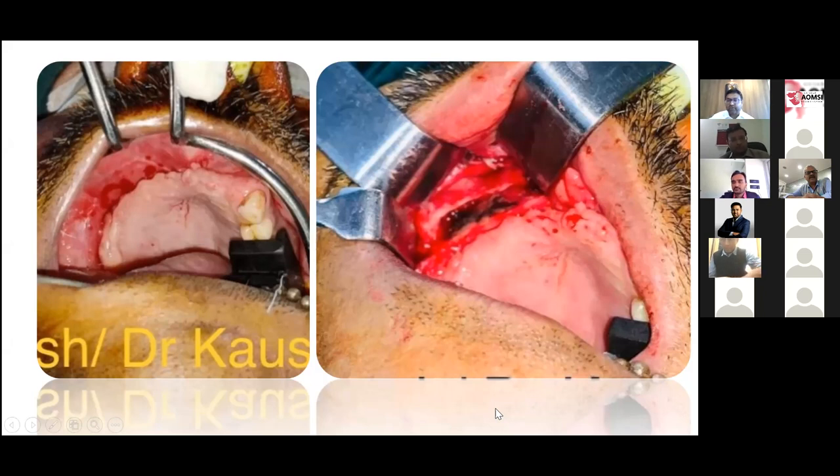Okay, thank you. Can I say something, Kaustubh? Yeah, please go ahead, sir. So I think here, I would like Nihal's opinion also, because these are challenging cases for the zygoma when it comes to unilateral. Because zygoma classically should always have a bilateral splinting for stability, for the prosthesis and everything. The other problem that we see with unilateral ones is getting the angulation right when teeth are present, as we have already experienced.